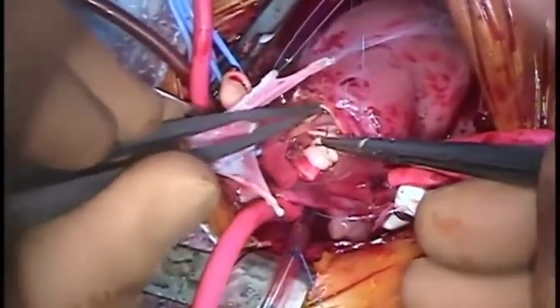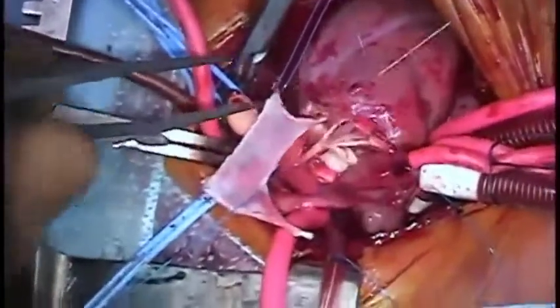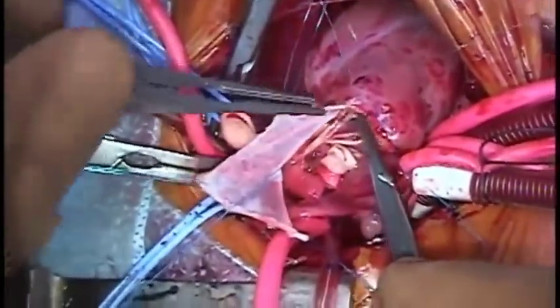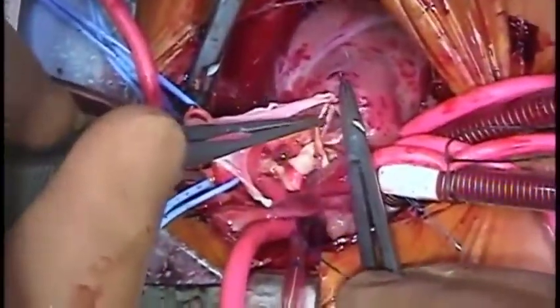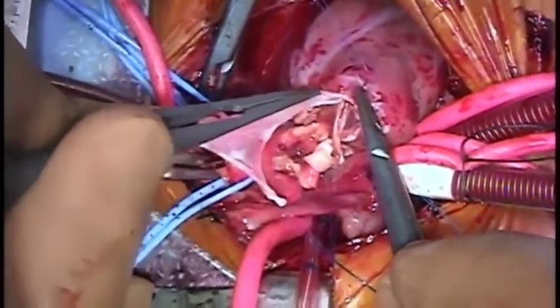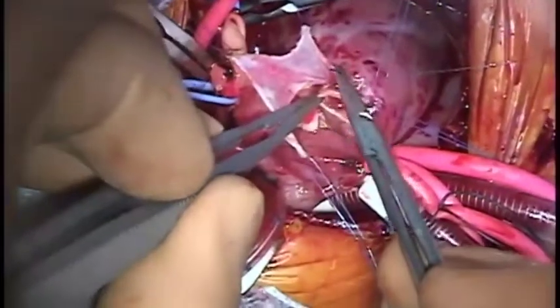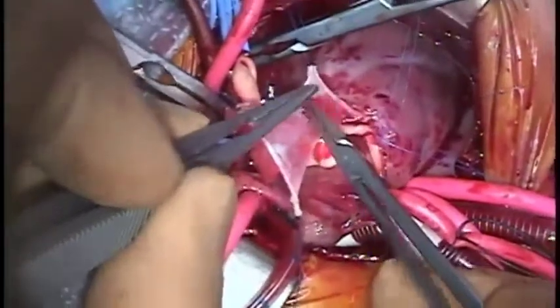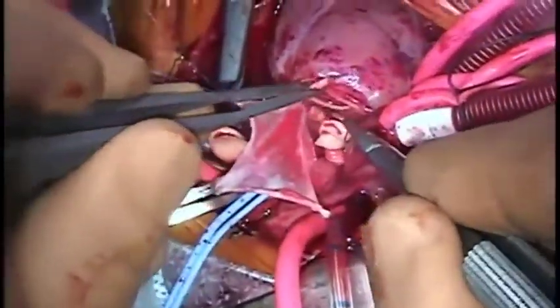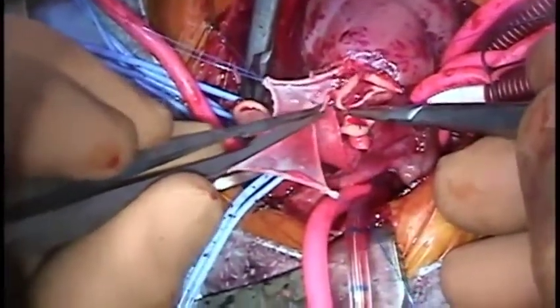The reconstruction of the neopulmonary artery using the autologous pericardial patch is now commenced in the corner farthest from the surgeon. This is done prior to coronary implantation in order to afford better access to the space between the great vessels. Note that the suture line is not taken up the commissural post between the excised coronary buttons, but is instead taken across the back of the post at the level of the annulus by taking tangential bites of the arterial wall. This saves at least 5 minutes and has no impact on valve function.